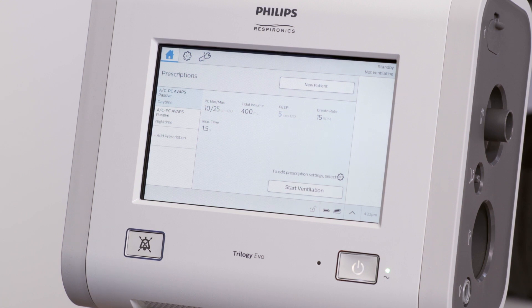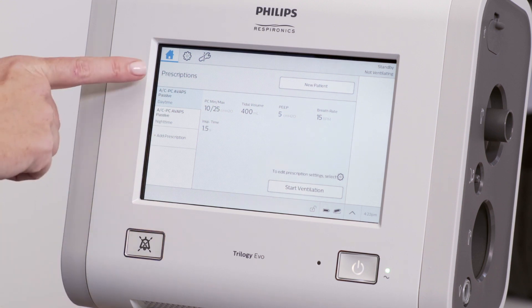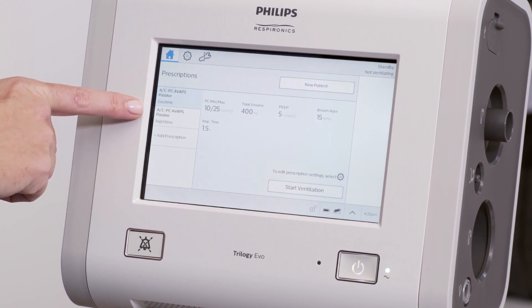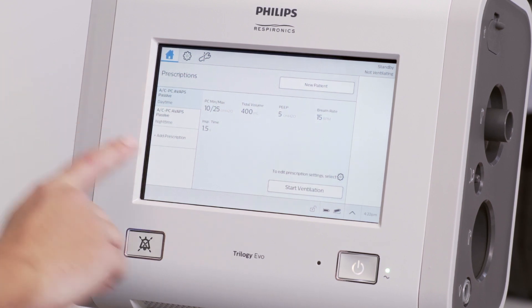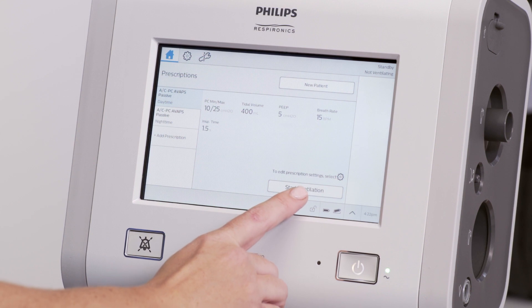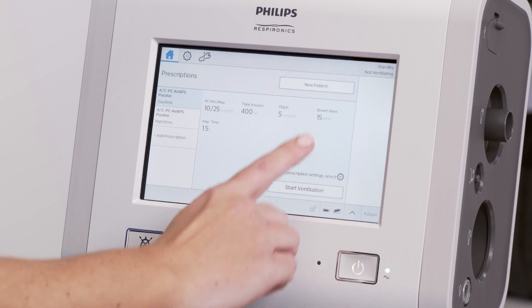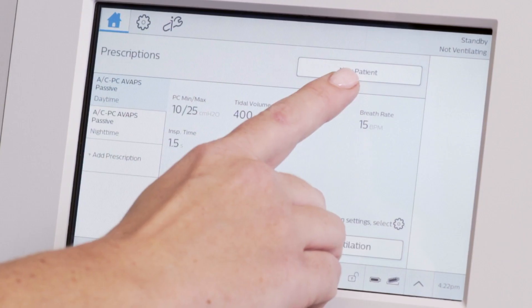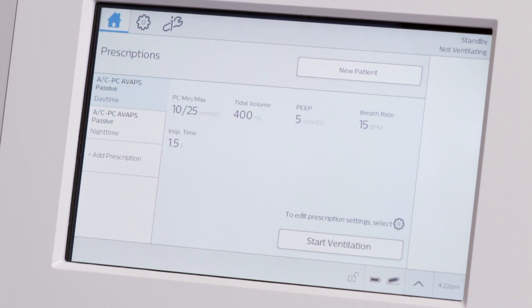While in standby on the home window, you can view the entered prescriptions on the left-hand side. On the bottom right of the window, find Start Ventilation. The New Patient option is in the top right section.